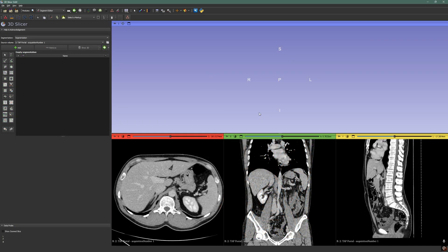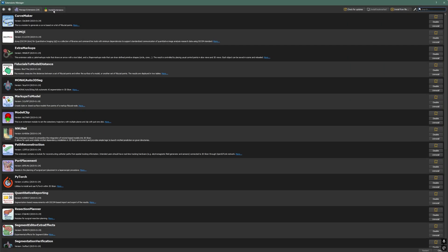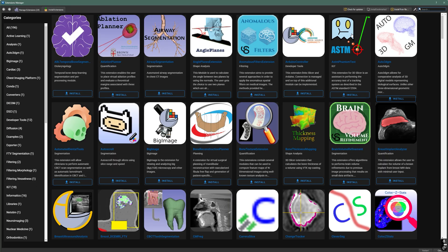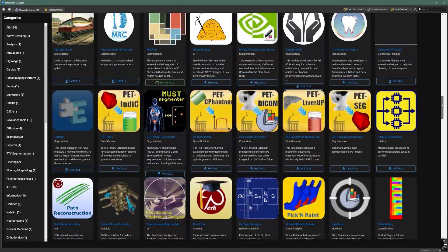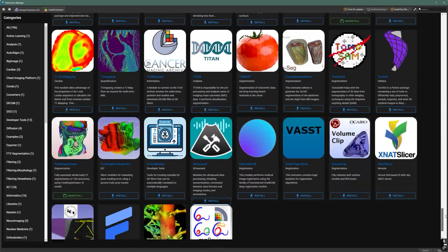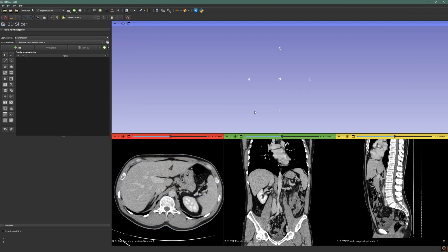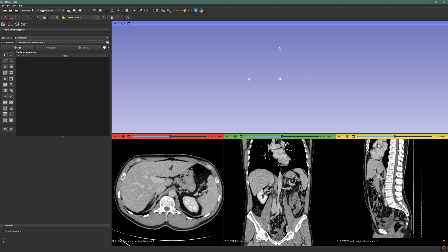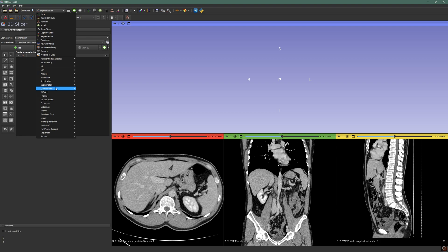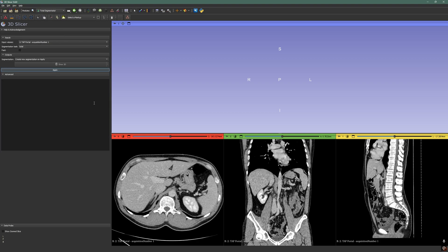The installation of TotalSegmentator is very simple. You just need to go into the Extension Manager — either here or in View > Extension Manager — and click on Install Extensions. You will scroll all the way down and find TotalSegmentator, click Install, and restart 3D Slicer. Once it's done, you need to load a CT scan, go into Modules, then Segmentation, and then TotalSegmentator.